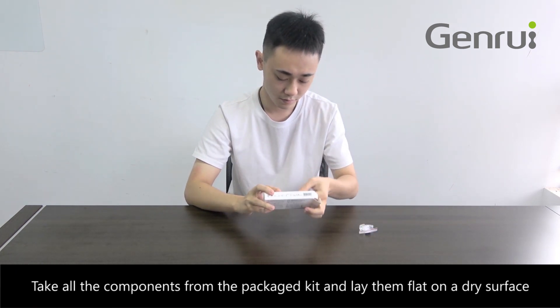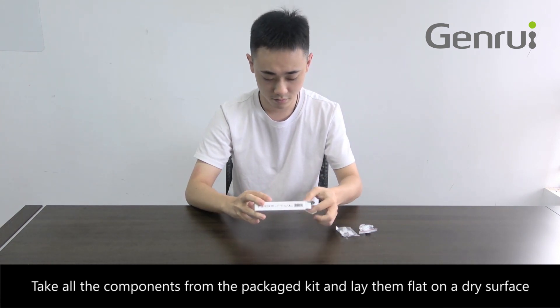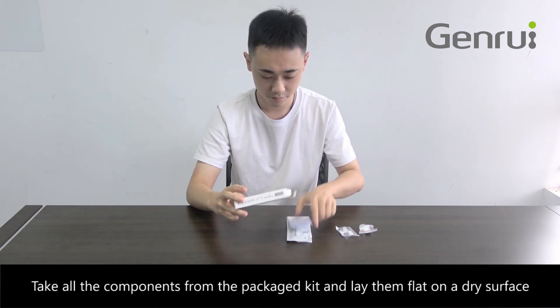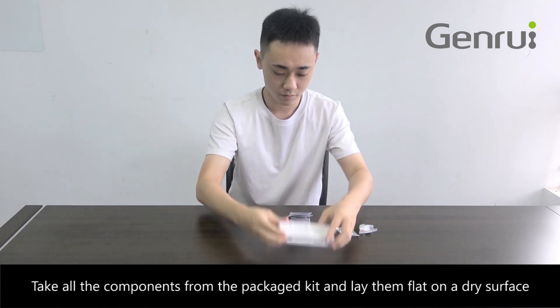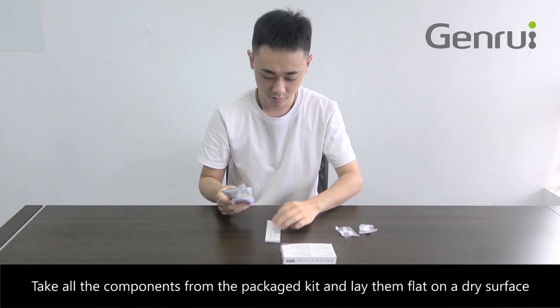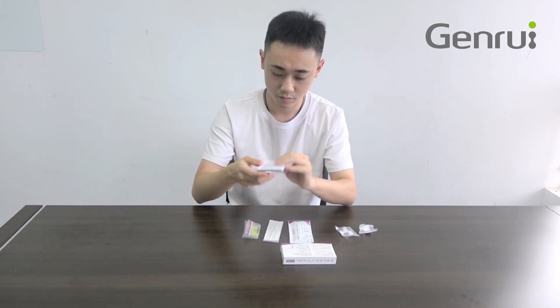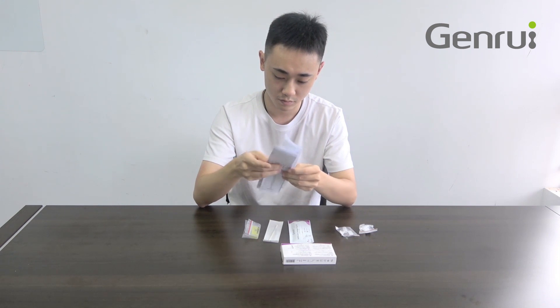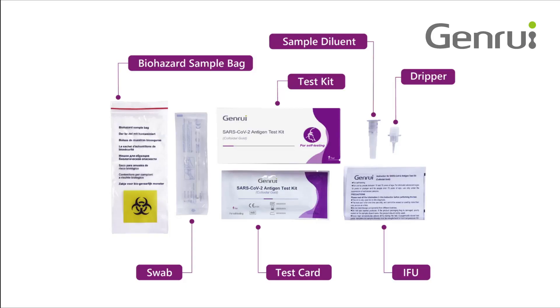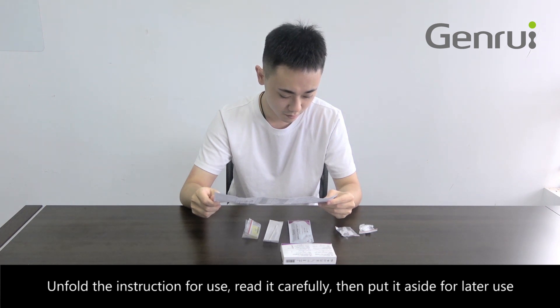Take all the components from the packaged kit and lay them flat on a dry surface. Unfold the instruction for use, read it carefully, then put it aside for later use.